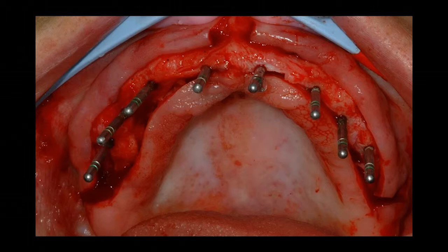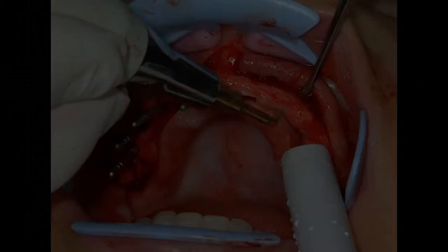Here's another case. This lady had an implant fail here. They went and put another one over here. This one has completely lost integration. There's no occlusion over here. So looking up close, you see bad peri-implantitis infection here.